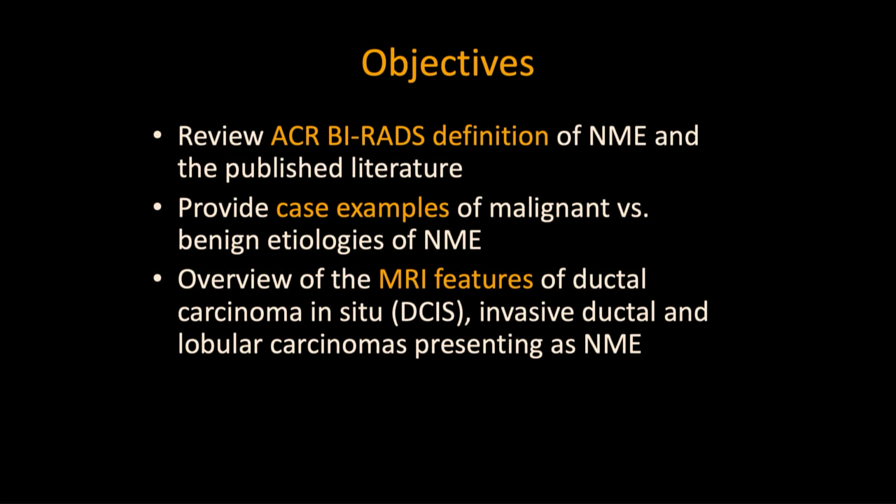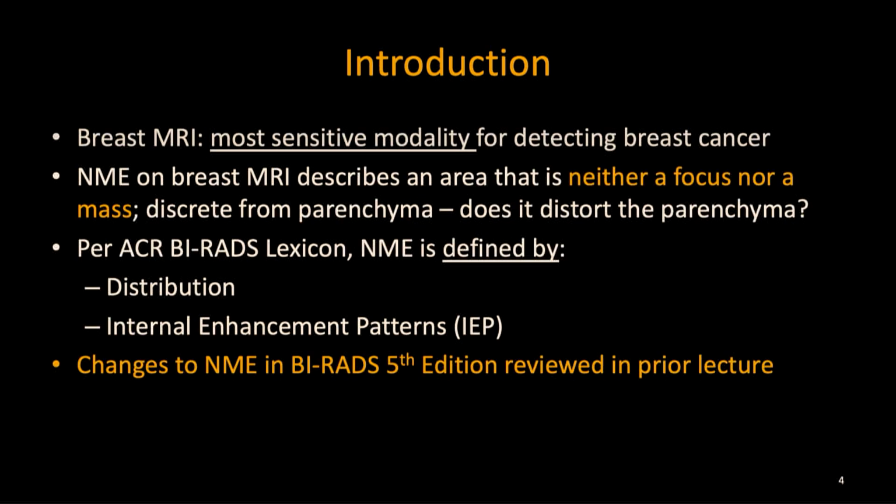The objectives of today's session are defining the BI-RADS definition of non-mass enhancement and reviewing the published literature. I'm going to give some case examples of benign versus malignant etiologies of non-mass enhancement, and I will review the MRI features of ductal carcinoma in situ, invasive ductal and lobular carcinomas presenting as NME. As we've talked about, breast MRI is the most sensitive modality for detecting breast cancer. And NME is a little bit different.